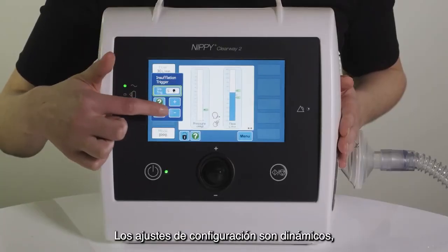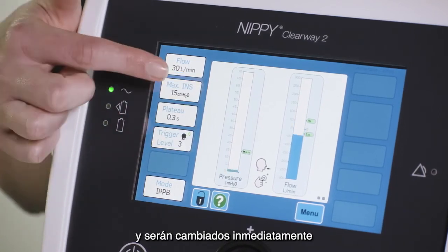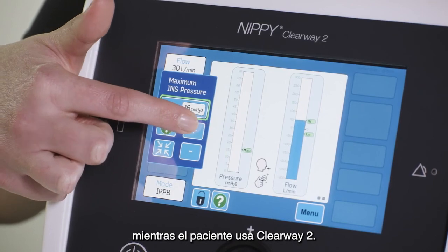Setting adjustments are dynamic, meaning you can change settings while somebody is using the Clearway 2 and they will be changed immediately while the patient is using the device.